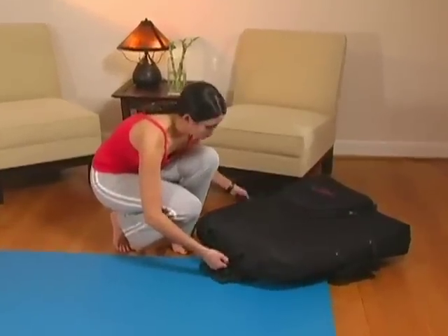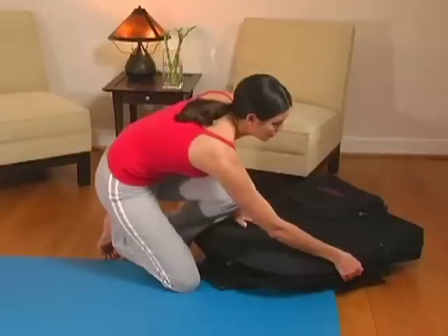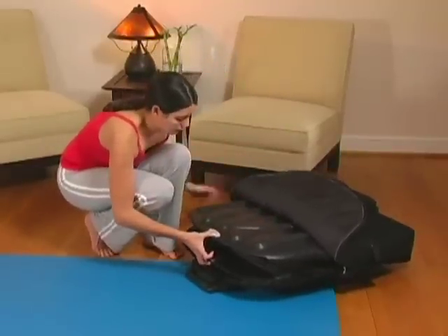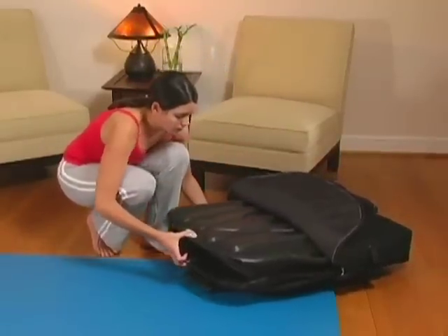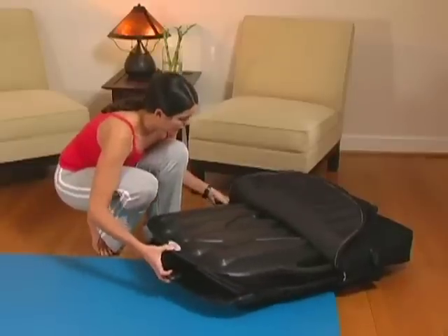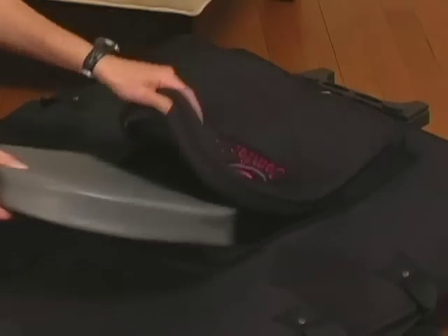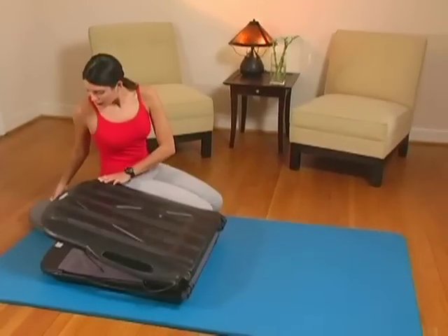To begin, remove the ComfortTrack lumbar traction unit from the custom portable carrying case and onto a flat firm surface. To do this, lie the case down on its side and simply slide out the unit. Remove the head pillow from the pouch conveniently located on the front of the case.